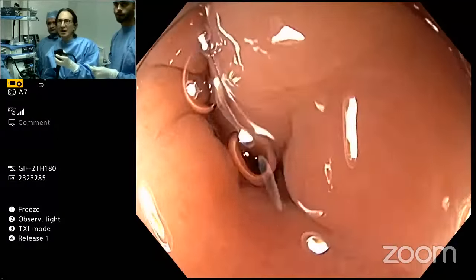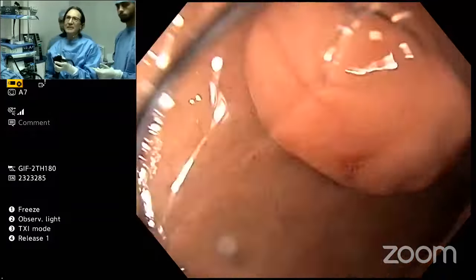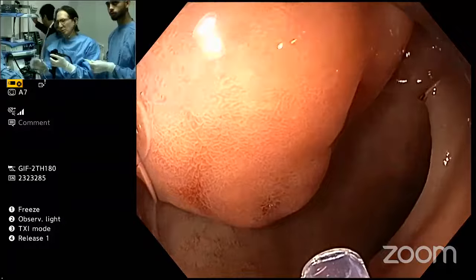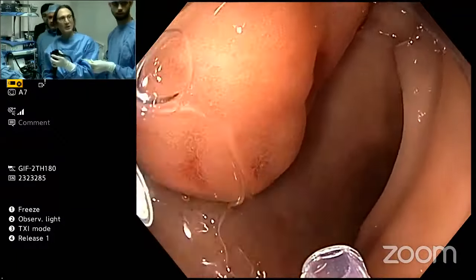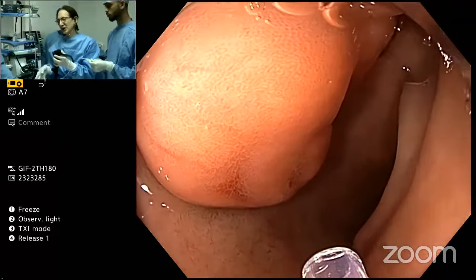All right, so now I'm just going to go inside. Patient's waking up a little bit here, needs a little bit more. Let's give some of that Buscopan now too. Okay. All right, here's our lesion, a lipoma. So let me just show you how we can deploy this. Well, we'll wait for her to calm down. We want the patient to be comfortable. Is this propofol we're doing? Now, propofol, good. All right. You can see she's talking to us.